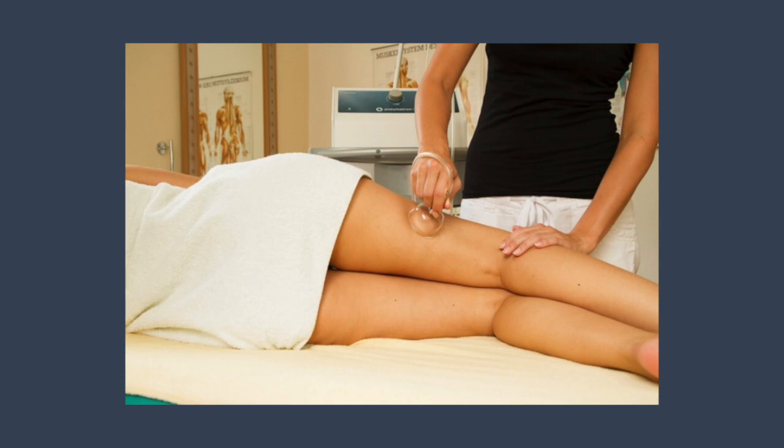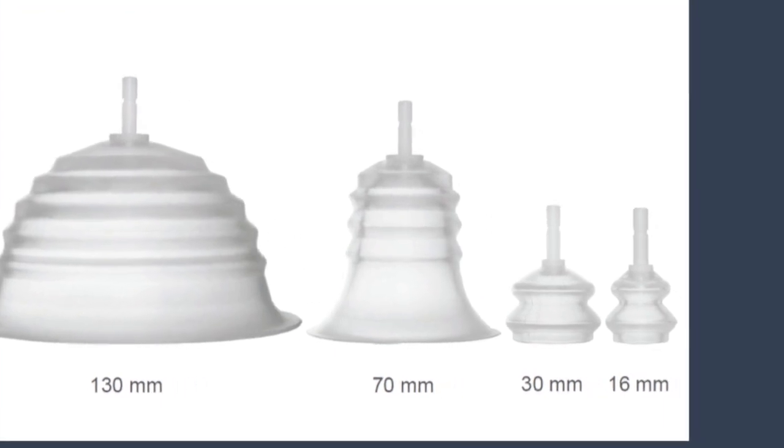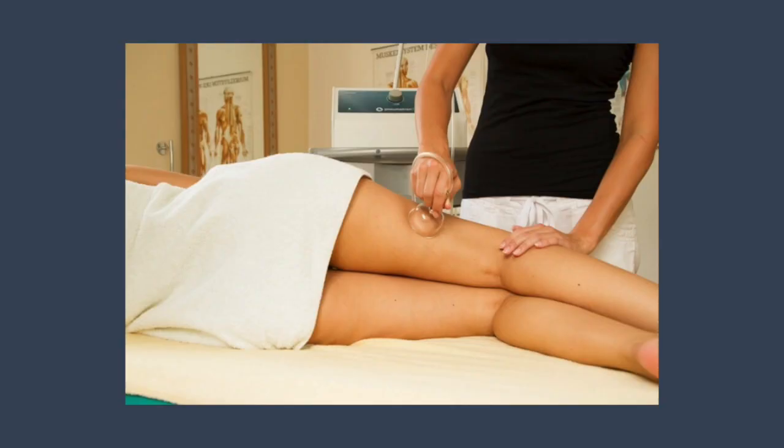Here you can see the use of the single hose in a genuine glass cup. If treatment is initially considered to be painful, massage like this with a single tube and a 7 cm silicone cup, always following by stroking the treated area with your free hand. In the case of severe hyperacidity, you will find that you can gradually increase the intensity of the treatment from treatment to treatment.